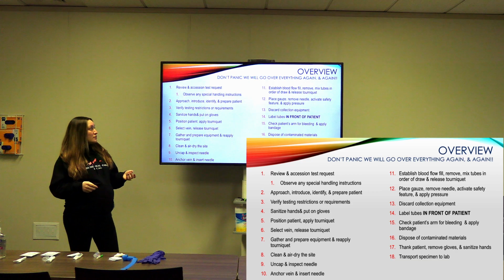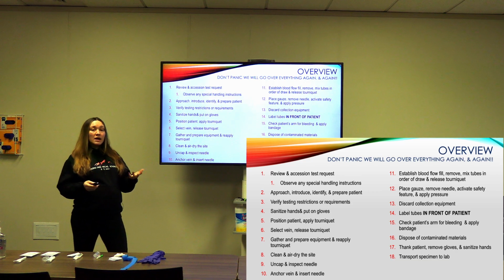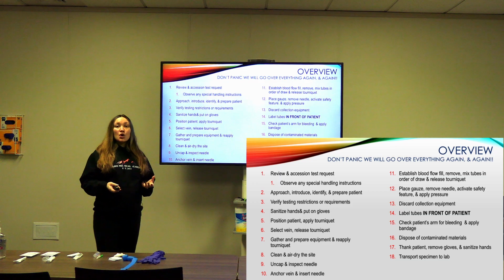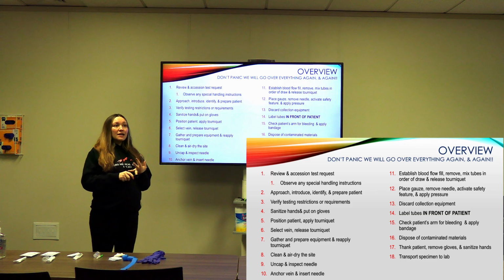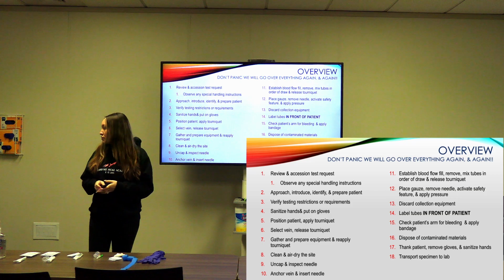Then communicate with them, prepare them, just let them know I'm going to gather my equipment, or I'm going to tie the tourniquet on you and find a vein. Do you have an arm that you prefer? Ask them clarification questions. Are you allergic to alcohol? Are you allergic to latex? Are you allergic to tape? Okay, so on and so forth.